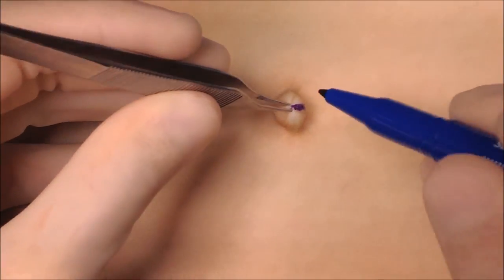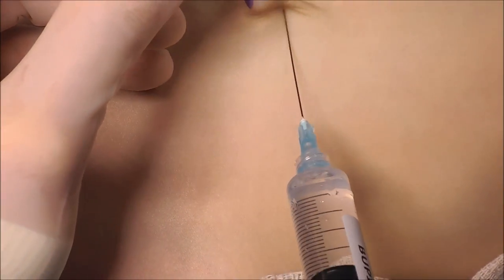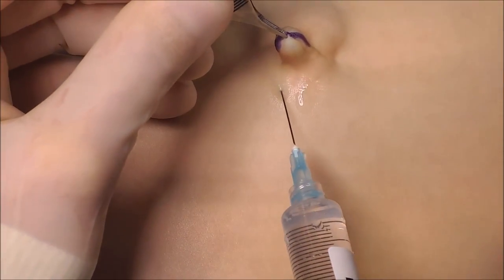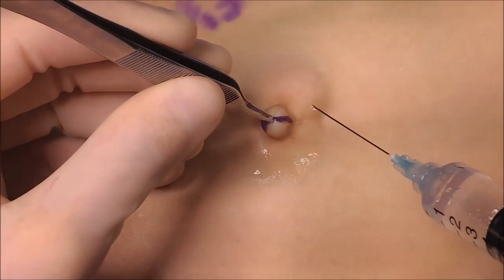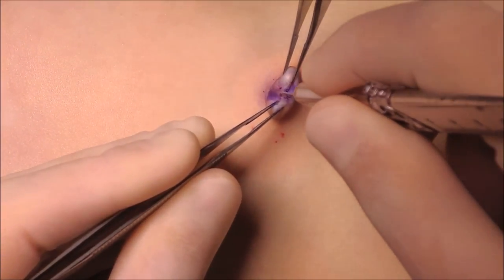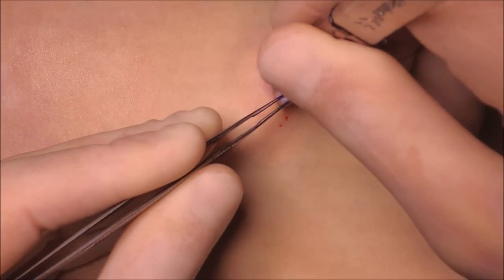The incision is made in the middle of the belly button. We use 0.5% bupivacaine. Most babies have a natural hernia, so as soon as the skin is cut, access into the peritoneum is achieved.